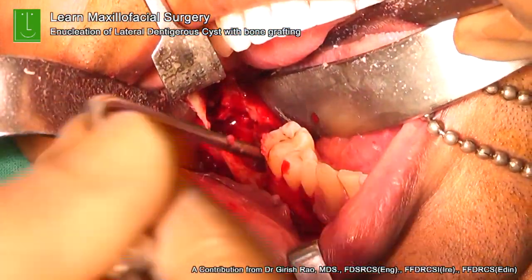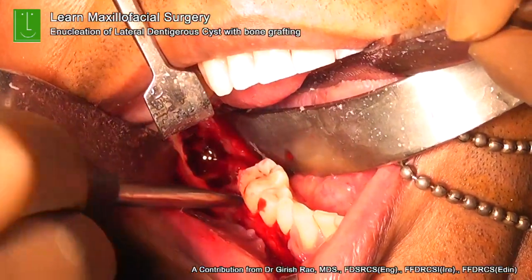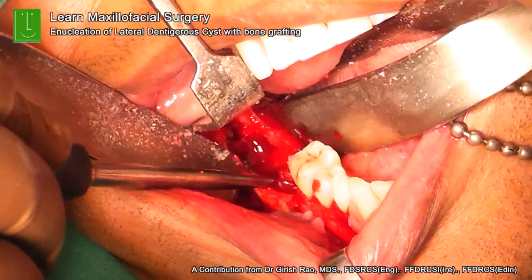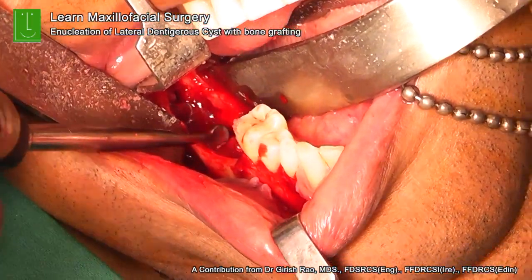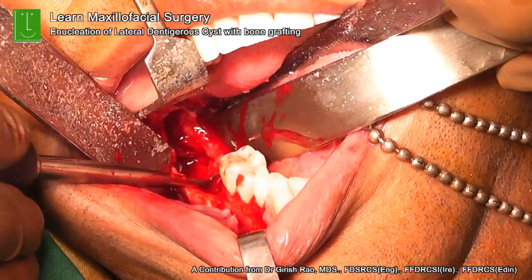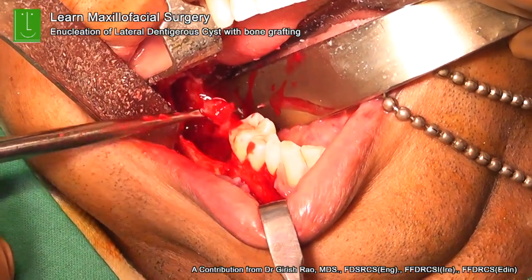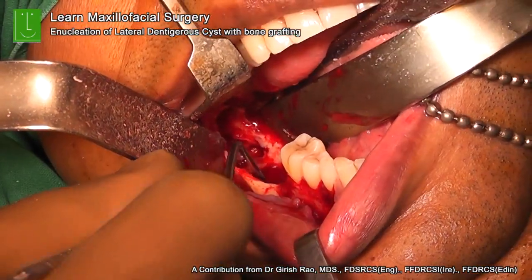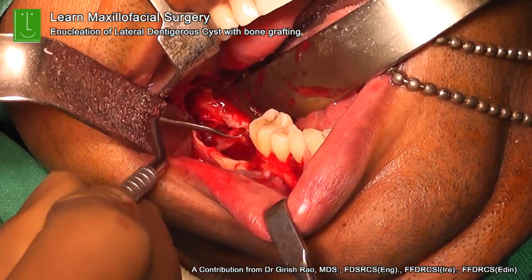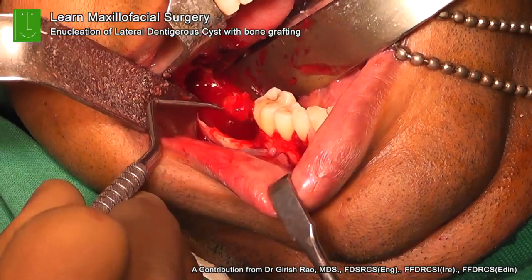Having removed the tooth, now you can see the remnant part of the cyst. So you use a Ward's curette and start enucleating the entire cyst, and that's what we're doing over there. Many a time small fragments are stuck, especially around the root sockets and below that, and it's absolutely important that you're very, very meticulous in terms of taking out the entire cyst lining. Different curettes can be used, different angulations, different sharpness of curettes. This is very, very important.